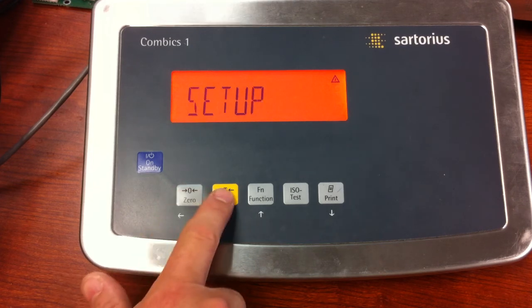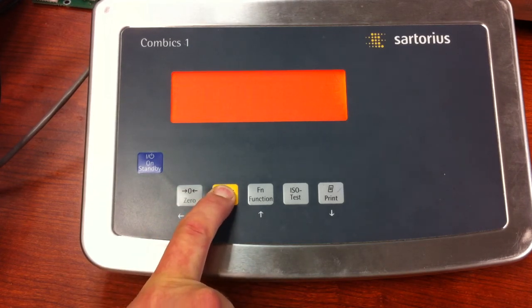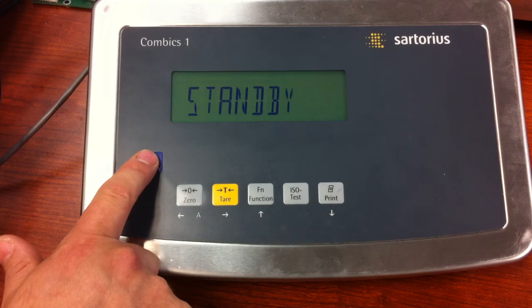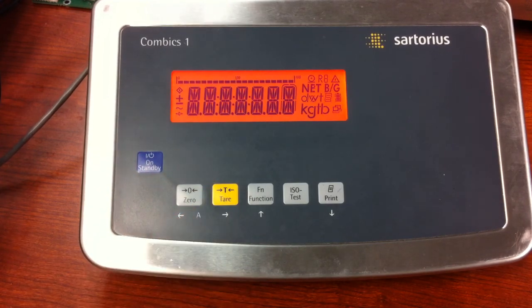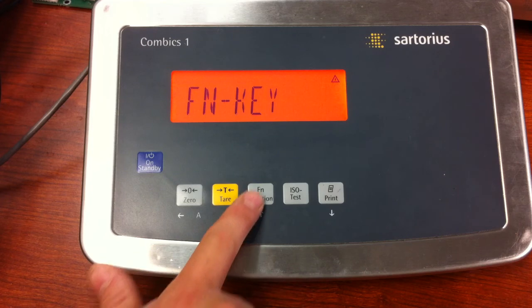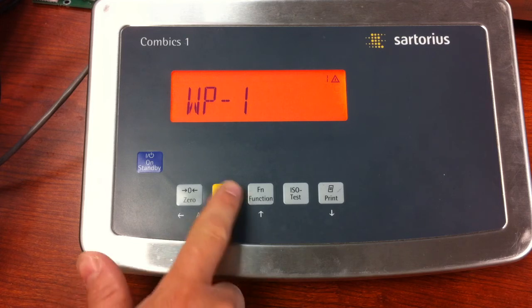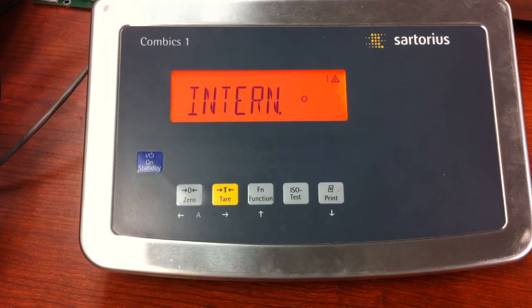Now all we need to do is reset the indicator by pressing and holding the tear key. When we go back in, we should be able to access the menu without using a password. Go to Setup, press the tear key, and as you can see, it goes right to WP1 without asking for a password.